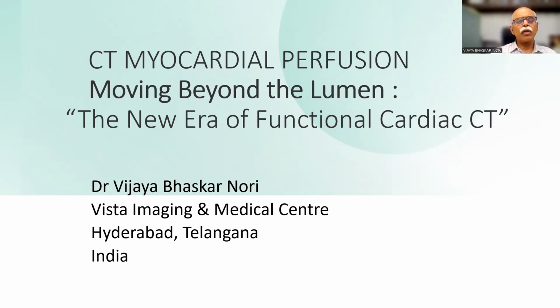Until now, we were doing mainly anatomical imaging, like quantifying stenosis. But now we can do physiological imaging, that is known as functional cardiac CT. And let me share with you some of my experiences and also the cases that we have done in the recent past about the CT myocardial perfusion in coronary artery disease.